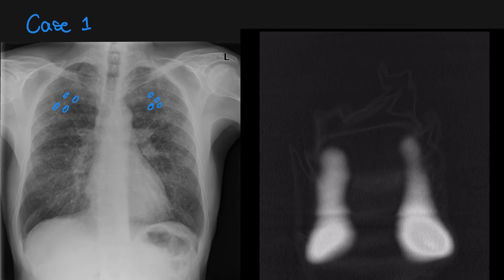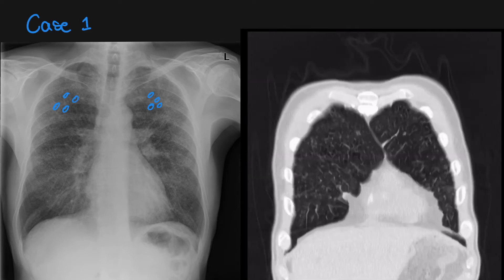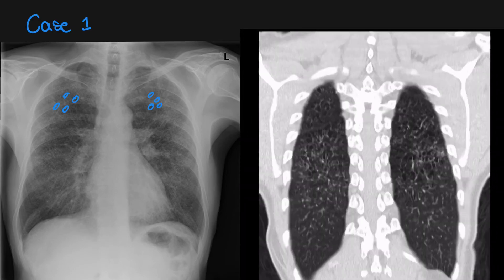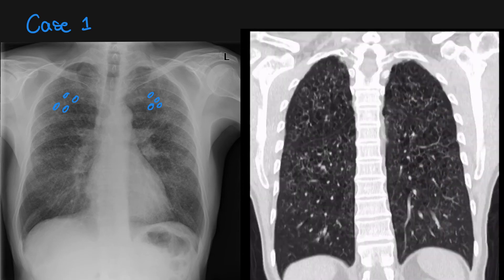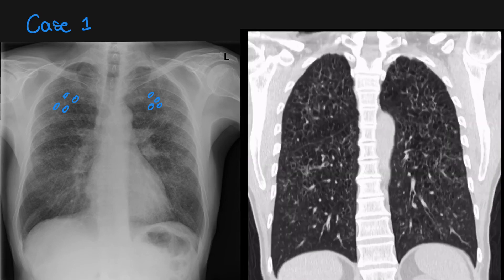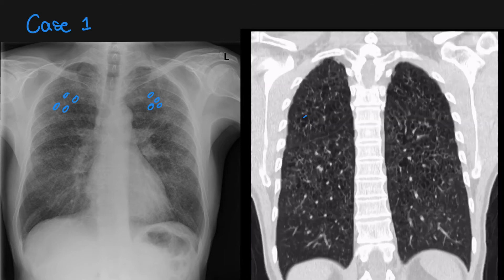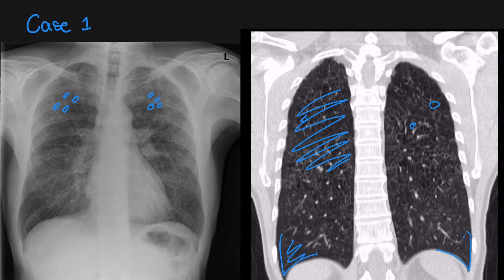The next thing to do for this patient is to do a CT, so let's have a look at the CT together. If we pause on this particular slice, you can see that there are bilateral thin-walled cysts which have unusual, bizarre shapes. Also, you can see that they're mostly in the upper and mid zones, and crucially, the costophrenic angles are spared. In summary, this is a diffuse cystic lung disease with an upper lobe predilection, and given the history of heavy smoking, the diagnosis here is LCH.